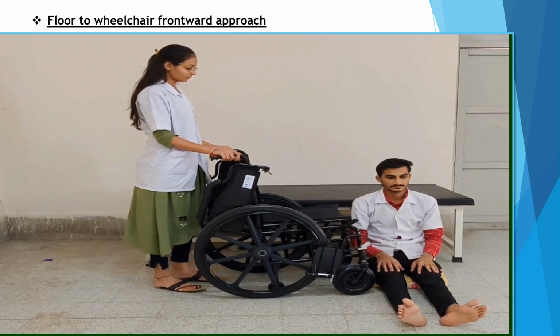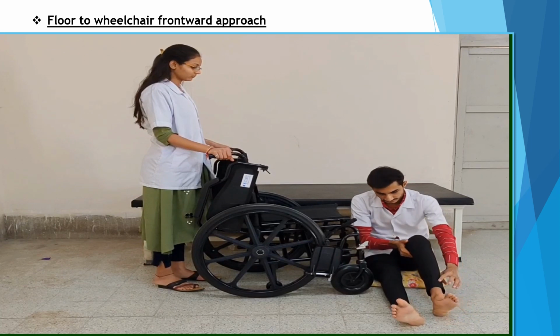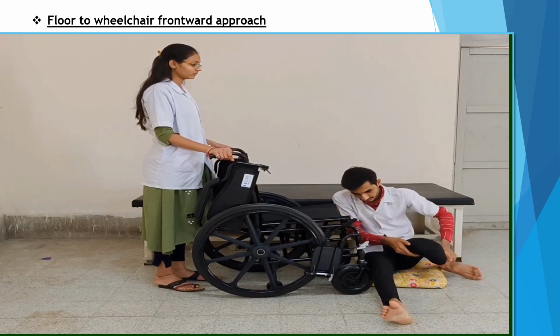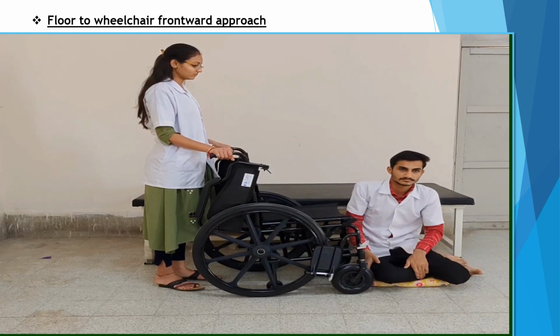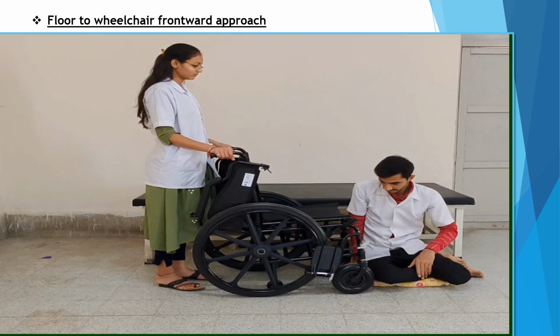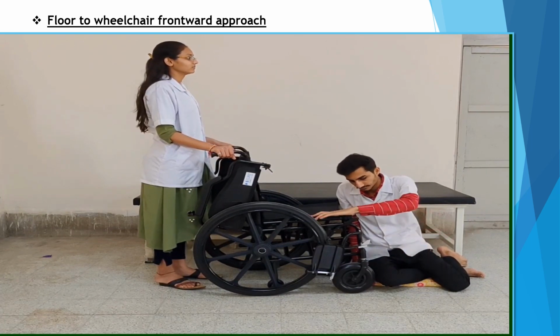Step 1. Positioning the legs and hands. The legs are passively flexed inward towards the underbelly of the wheelchair. One hand is placed onto the ground while the other at the front corner of the wheelchair.